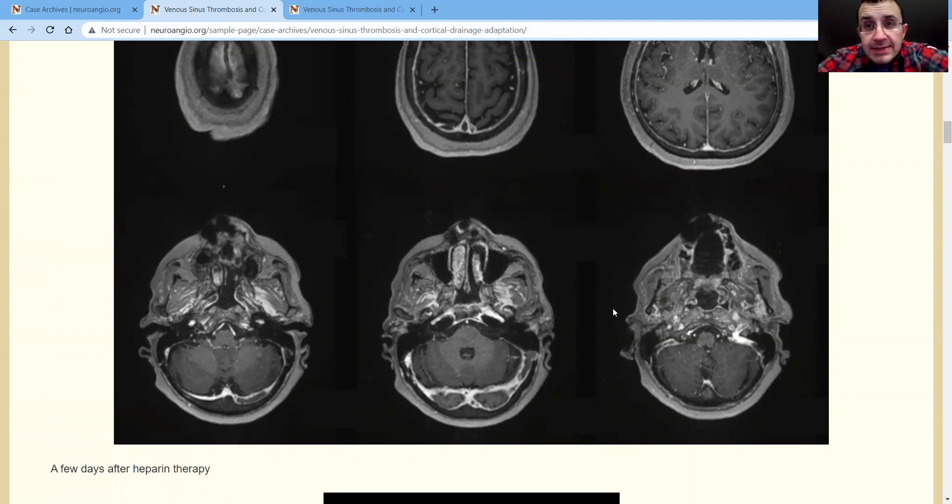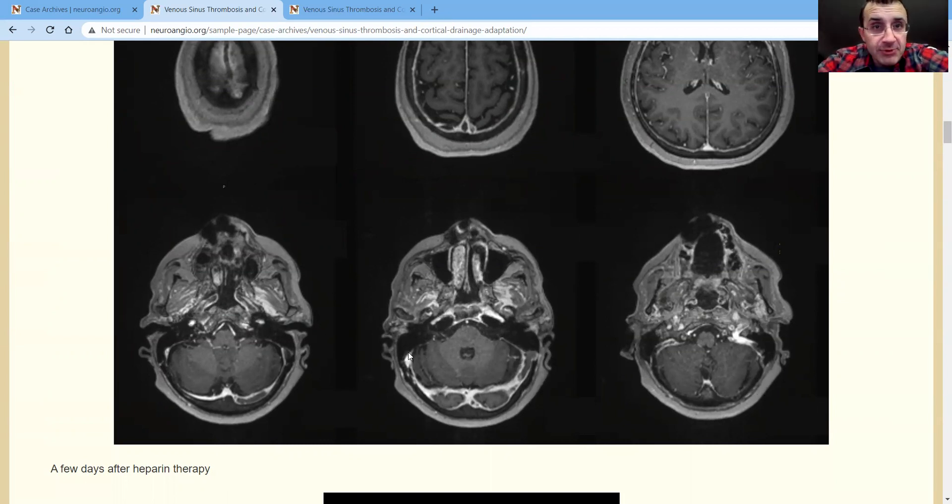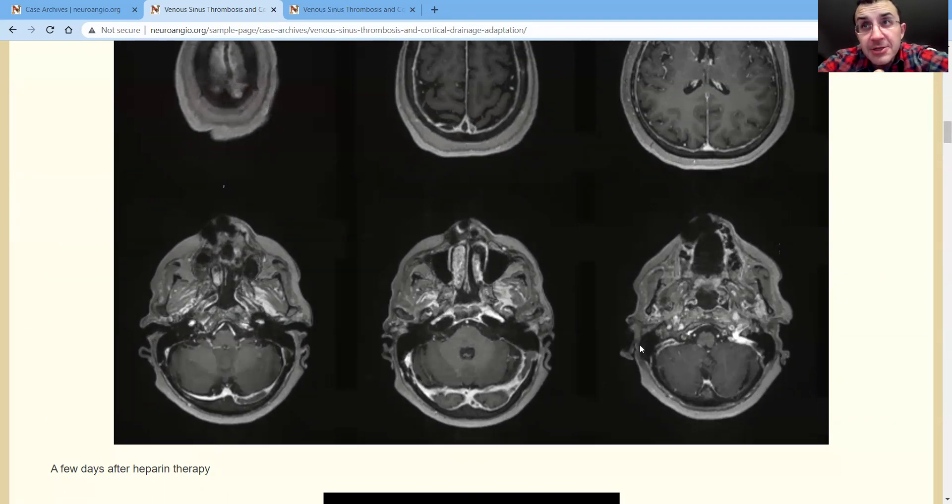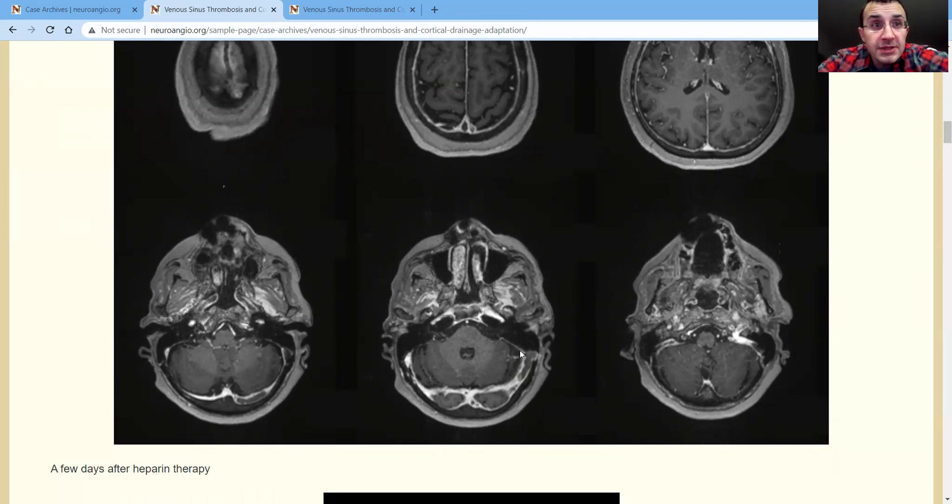On the right side, which is slightly developmentally smaller, we see that transverse seems okay, but there is some stuff in the sigmoid. It looks sub-occlusive, but it's hard to tell sometimes. The wall's enhancing. Hard to know. But this is what we have, generally speaking.